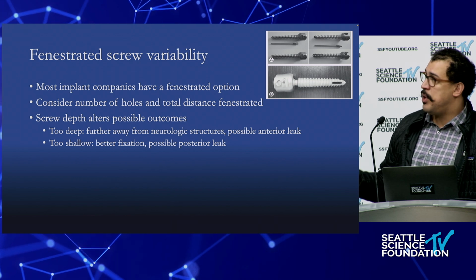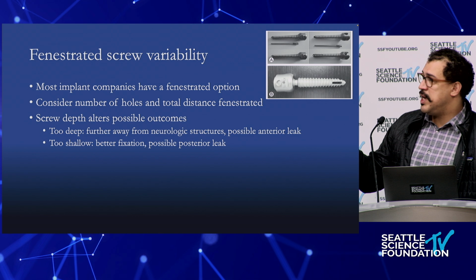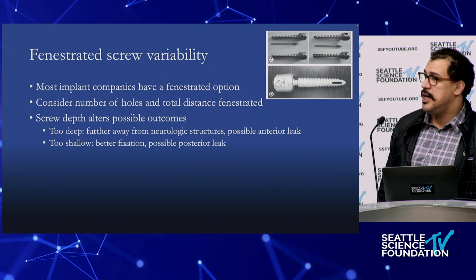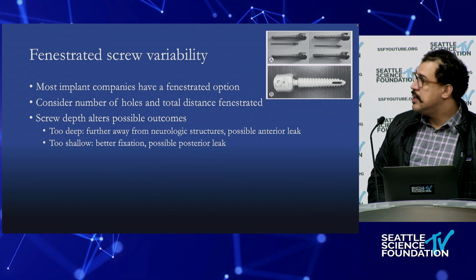And I use pulse live fluoroscopy to make sure if there starts to be any extravasation, you stop there and not push the limits to try to get a little bit better fixation.